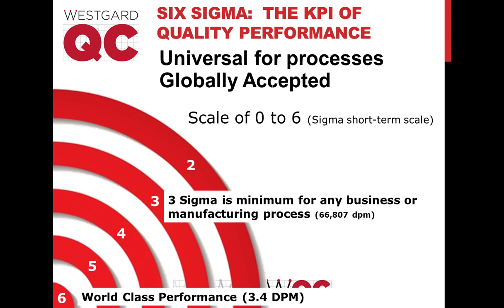Well, that's a good question. Let's back up and just acknowledge that while everyone believes there's one set of Westgard rules, and the 1981 paper made a particular set of rules famous, and many people take that as a standard, that is not carved in stone. The Westgard multi-rule approach is meant to be flexible.